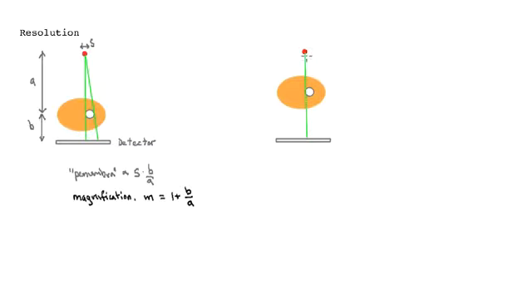And then you'll see now if I draw these lines that the magnification is much larger. It's bigger on the detector. But also the resolution is worse, right? Because we're closer to the source, what I call the penumbra is bigger. The B is larger. That sort of makes physical sense. So in this example here, the mag goes up and the resolution goes down.